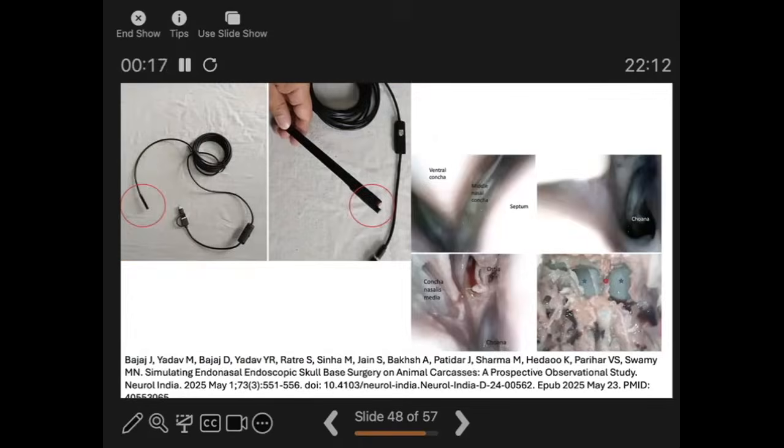We use the goat model for endoscopic transnasal training. For visualization, a boroscope with a 5 centimeter rigid distal segment is attached to an 18 centimeter long wooden stick to simulate a rigid endoscope. This allowed better positioning of the scope. Training was performed using the right and the left nostril of a goat head.